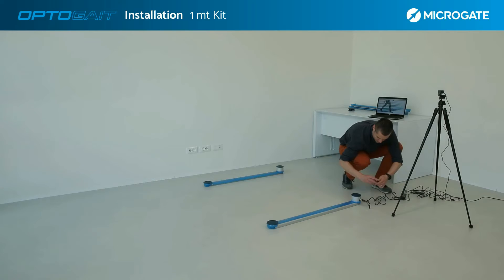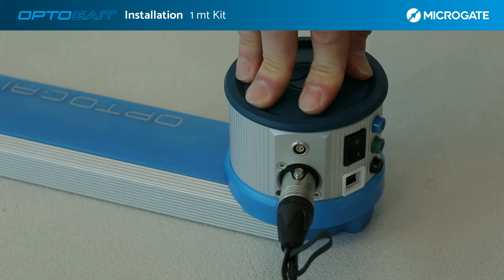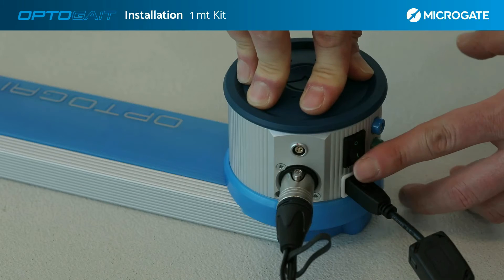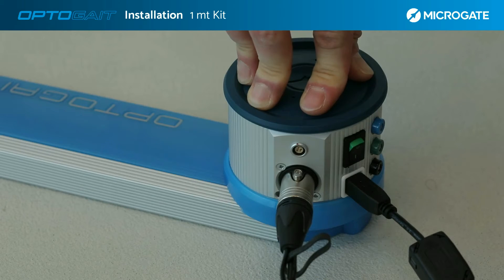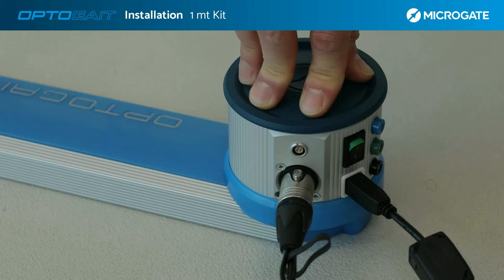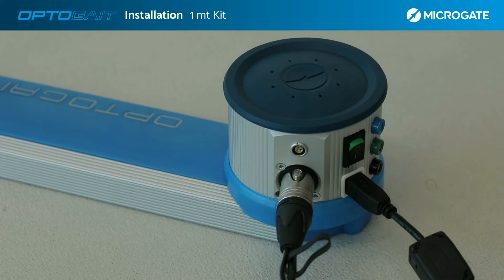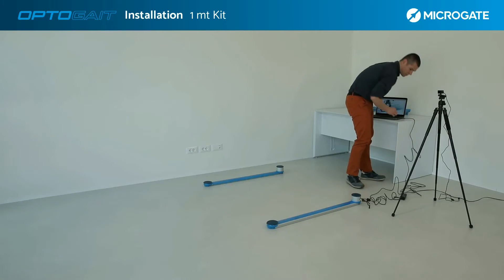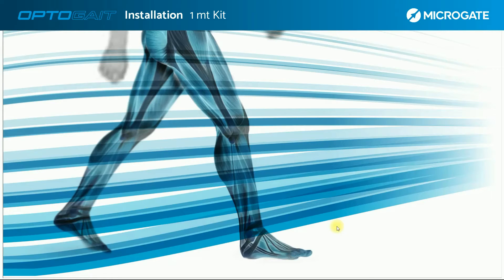In order to connect the system to the computer, it is necessary to connect the USB cable to the dedicated port in the interface, and then connect the other end to a predefined USB port on the computer. Once the bars are switched on again, if they are correctly installed, the software will display an acknowledgement message stating that the system is connected and ready to use.